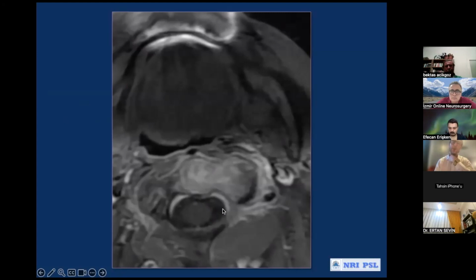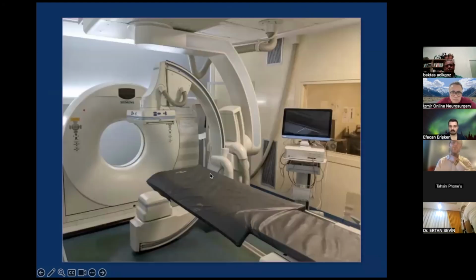There is no obvious epidural extension, but the lesion is located mainly on the left side and in the body of the C2 vertebra. This screw fixation, we can do in our hybrid angio suite, combining a CT scan and a monoplane flat panel, to have a good positioning of the screw. Or we can also do it in our biplane angio suite using the needle guidance technique.